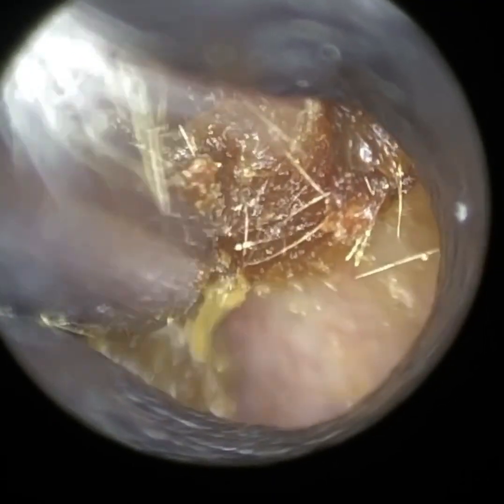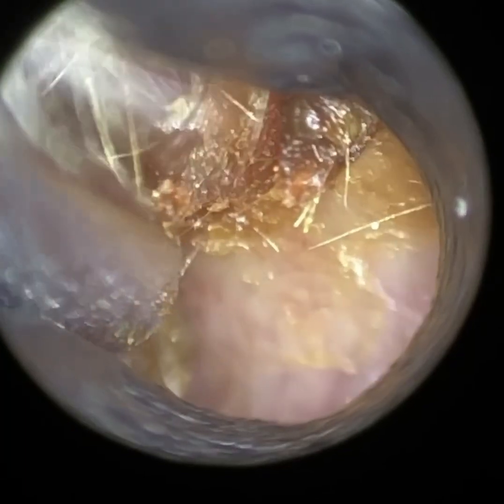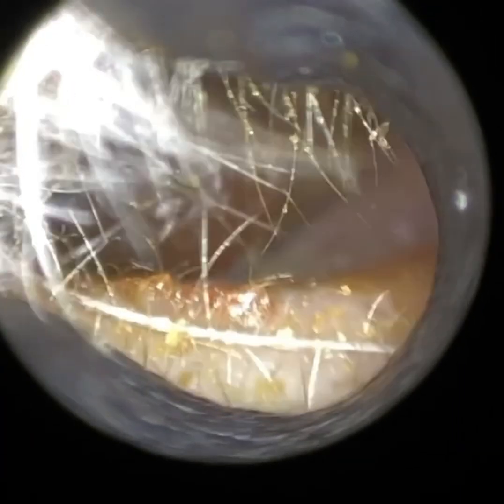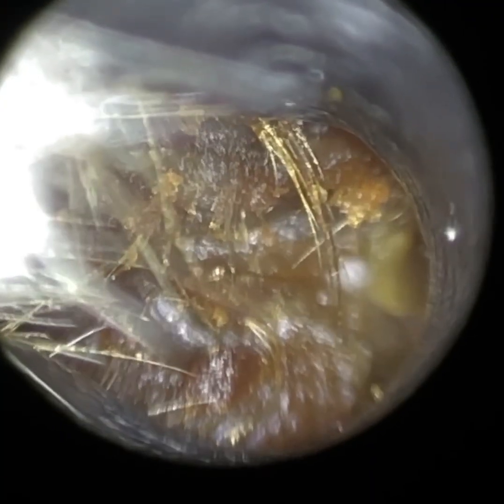To the point where they find it very difficult to visualise very deep in the ear. And you can see here we're beginning to remove the more lateral plug of wax. We're just using the speculum now — I'm actually using our 4.25mm speculum here.